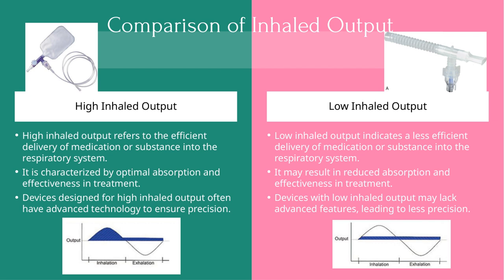Devices designed for high inhaled output often incorporate advanced technology to ensure that the delivery is precise and consistent. This is especially important because optimal delivery can lead to better patient outcomes. On the other hand, low inhaled output indicates a less efficient delivery of medication.